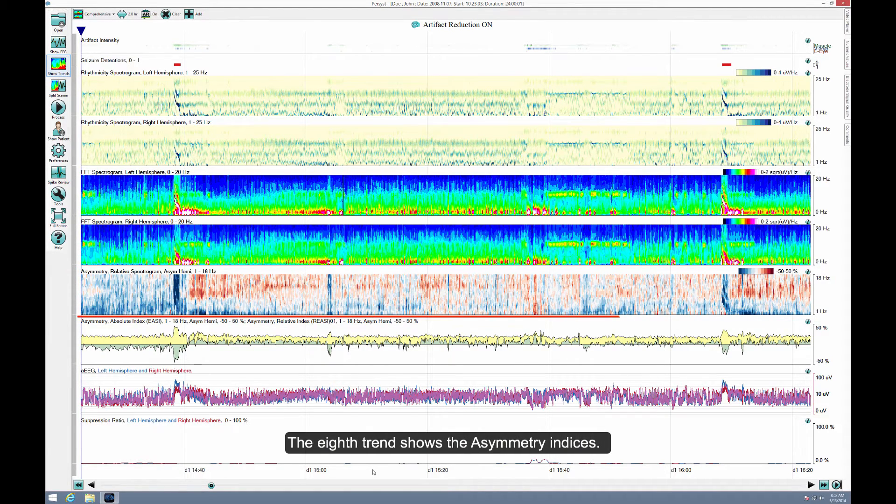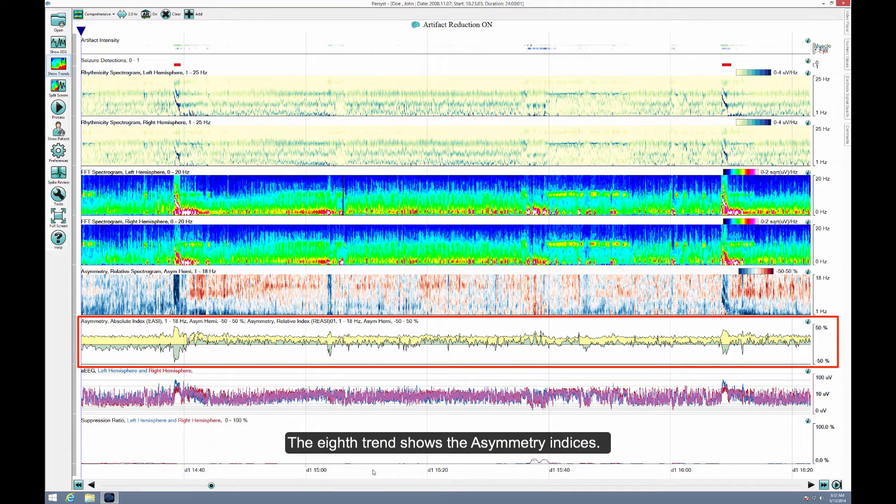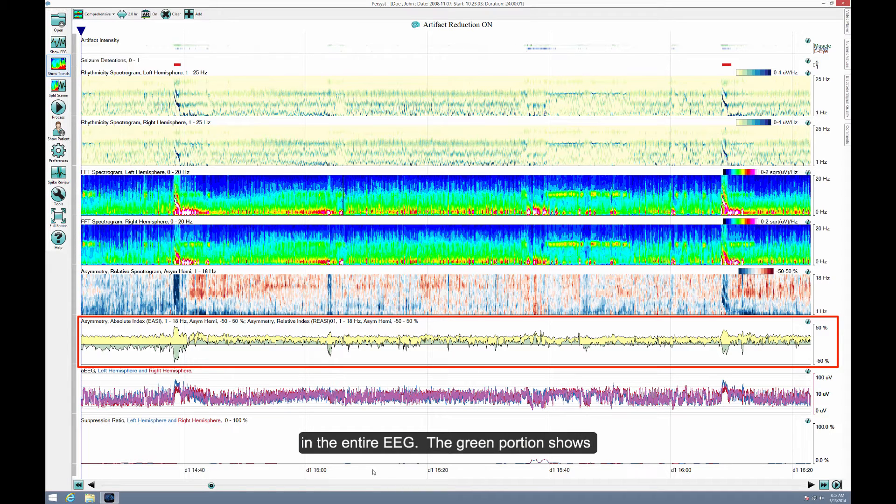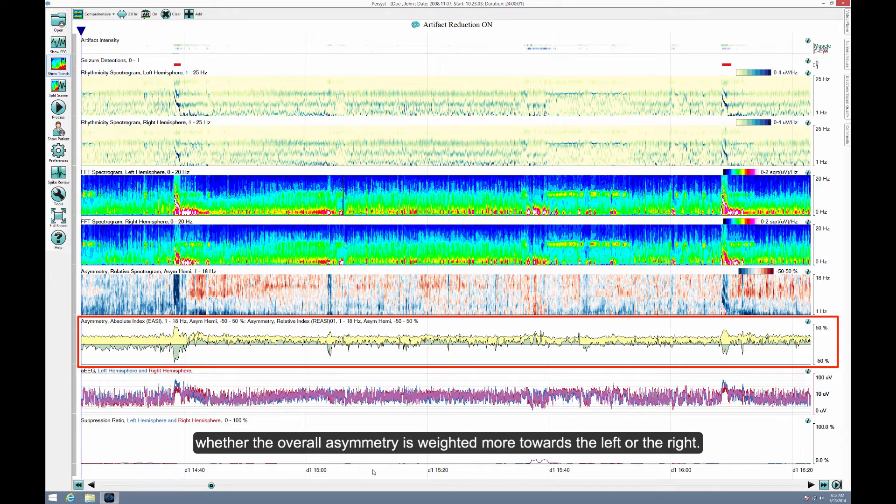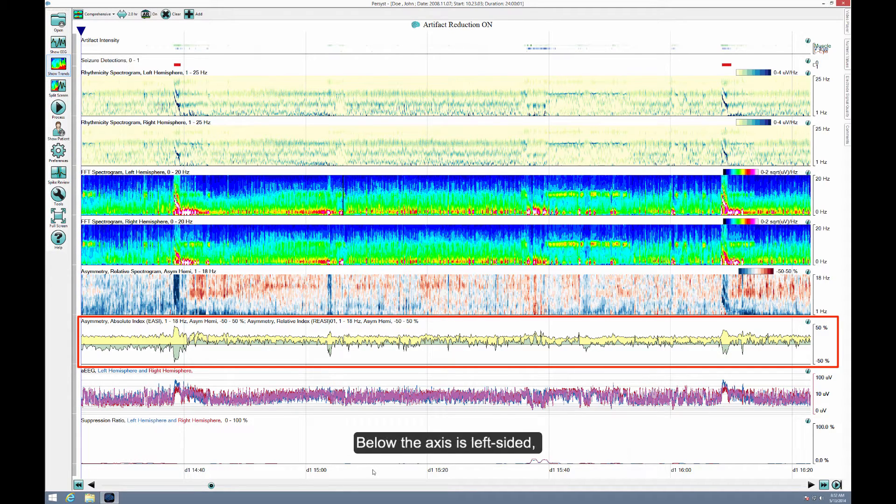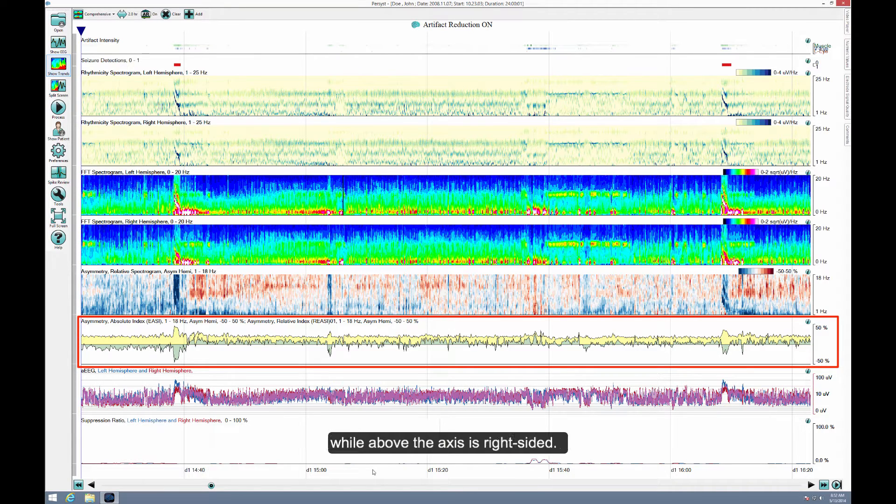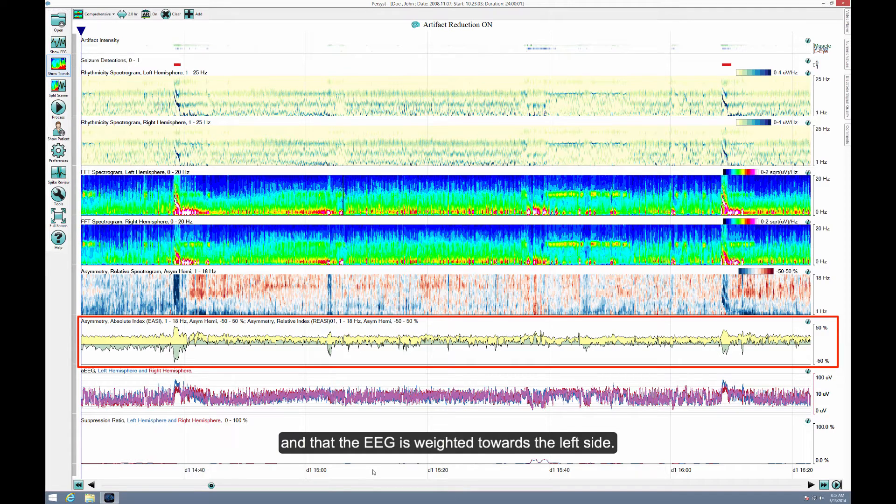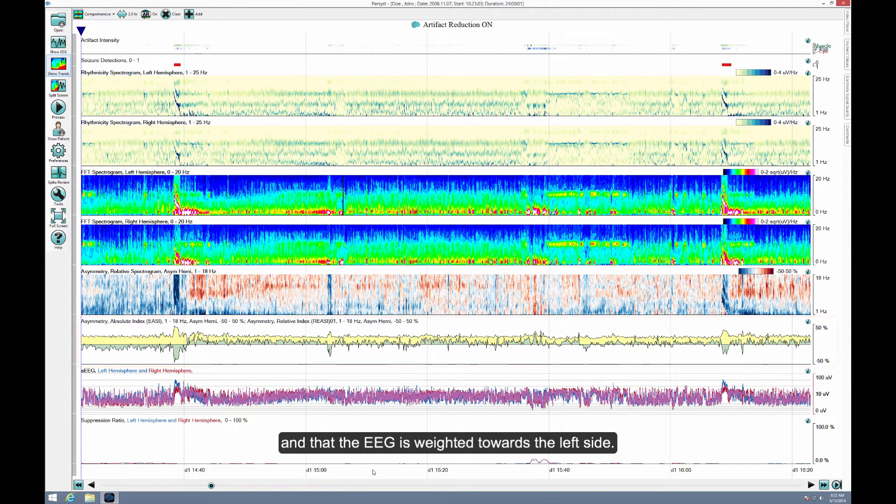The eighth trend shows the asymmetry indices. The yellow portion shows the absolute amount of asymmetry in the entire EEG. The green portion shows whether the overall asymmetry is weighted towards the left or the right. Below the axis is left-sided, while above the axis is right-sided. Again, we see the increase in asymmetry during the seizure, and that the EEG is weighted towards the left side.